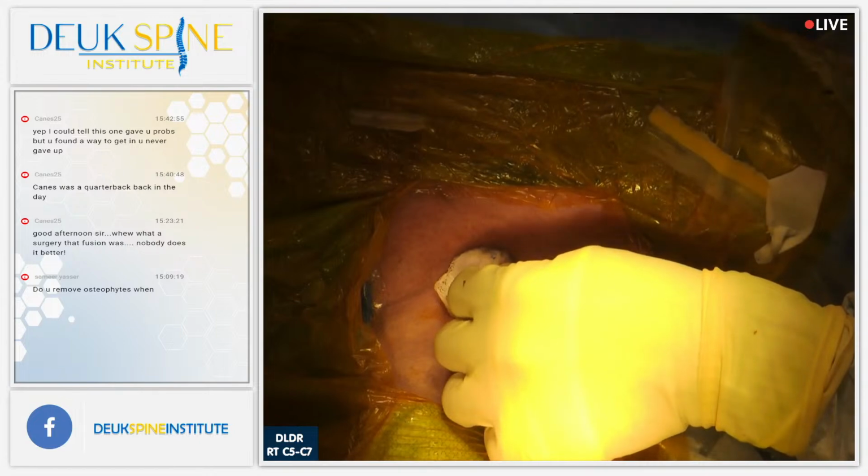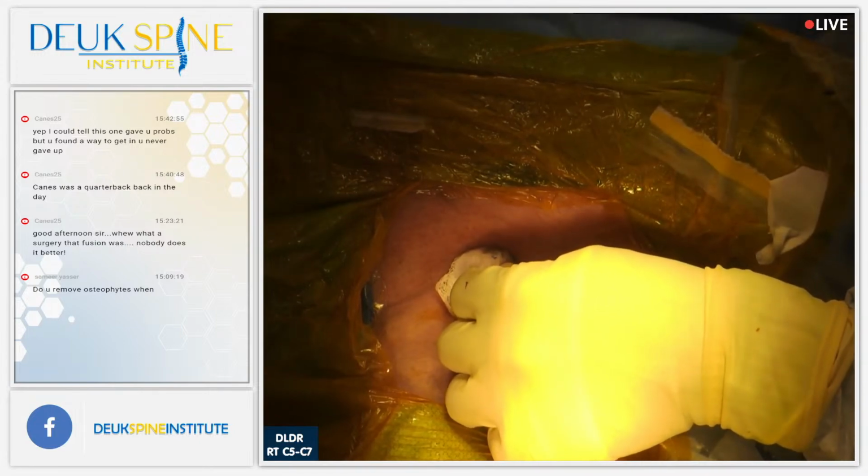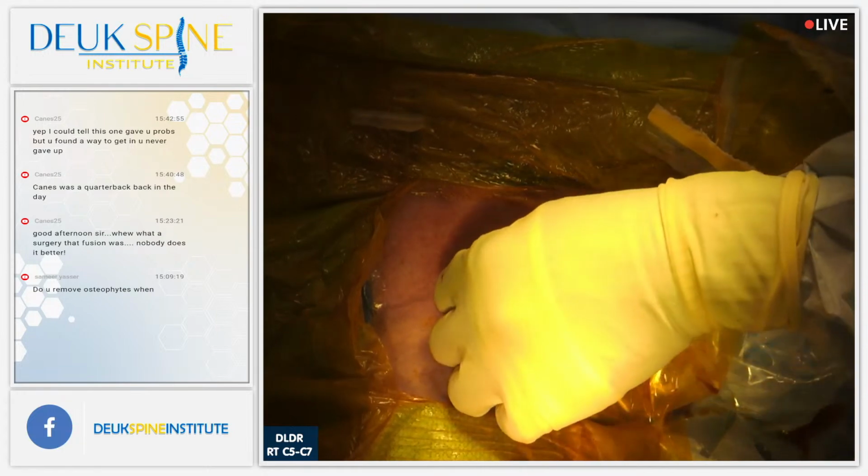Bit of a disappointing case overall. No stitch or a staple or anything, Dr. Deuk? No. We don't want an accumulation.